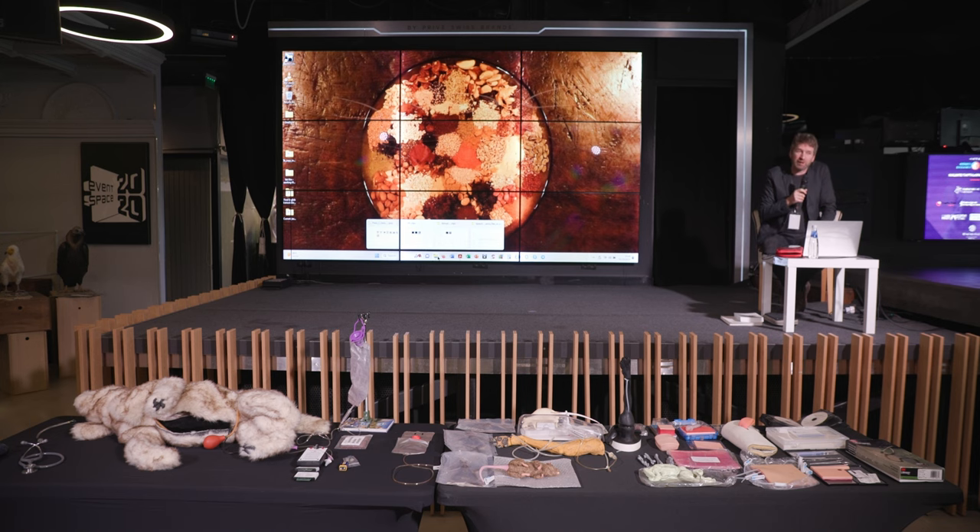Many of the organs are replaceable. You can buy replaceable parts from the company, and they're much cheaper than the full dog. The full dog itself is in the region of €20,000. But you can also buy the head and the neck, or the main body separately, and the individual organs separately, to replace the used items.